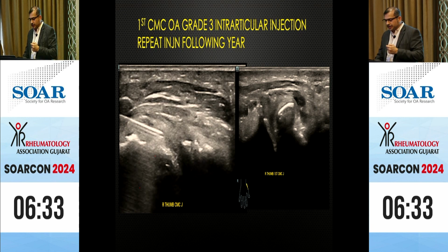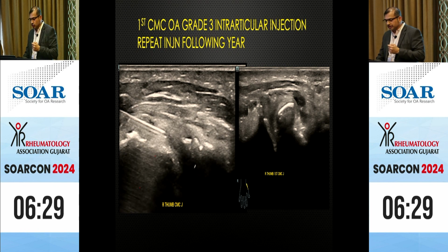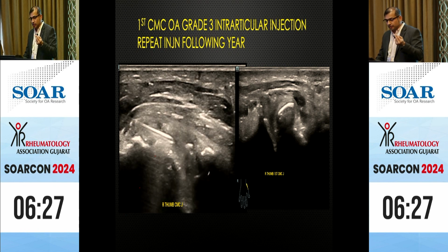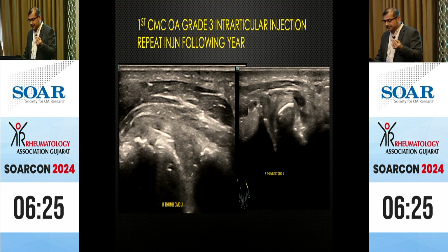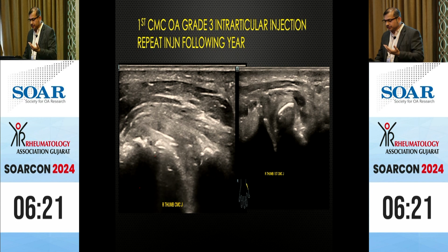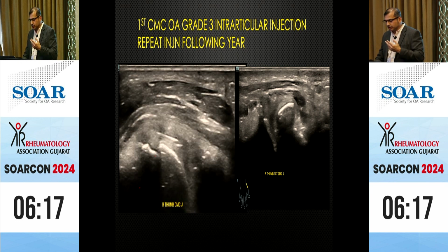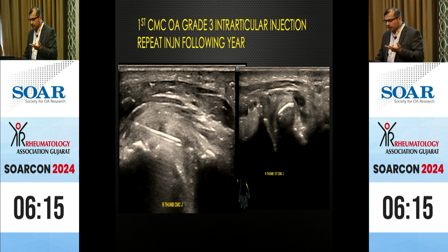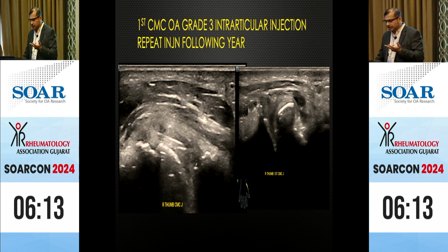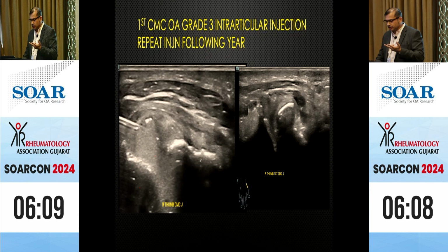And after you inject, once the dose spreads all over, you will be able to notice the exact amount of cartilage thickness which this joint has, the amount of osteophytes and the rough surface which this joint shows. Now you'll see slowly distension of the capsule. Already 1 ml, or more than 0.5 ml, has gone in. And there you can see these osteophytes there.